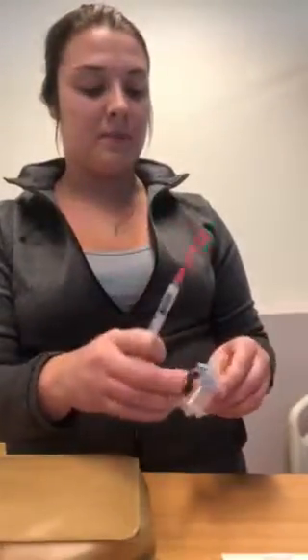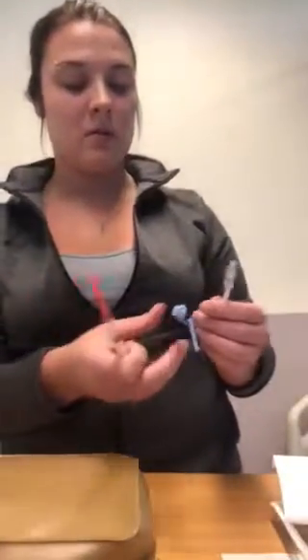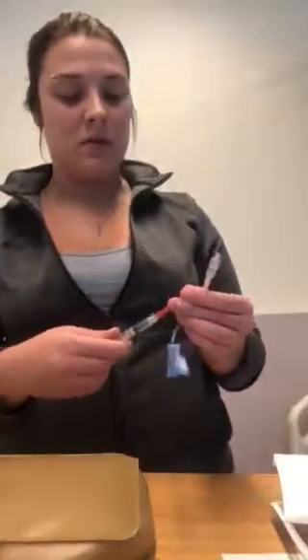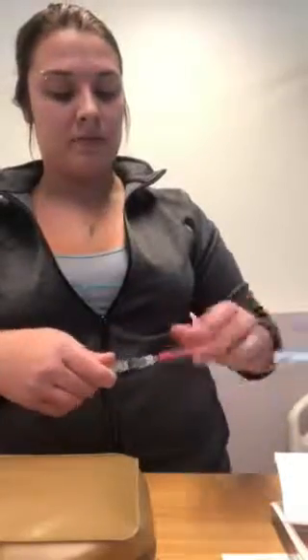Okay, so I'm going to go ahead and prime my tubing. I don't need to pull back to get it out because I'm just going right into the tubing. That will go in sharps.